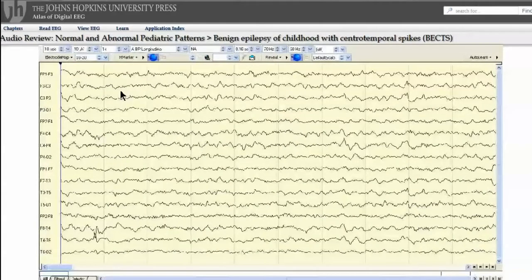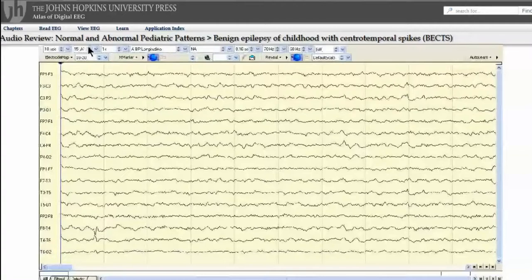This EEG segment in a child shows diffuse theta activity with low voltage faster beta activity superimposed. This is obtained from a sleeping child. We already see at the beginning a phase reversal at T4. To clarify this, we can decrease the gain even below the 10 microvolts per millimeter to 15, and we can see a blunted morphology, phase reversing at T4, with an aftergoing slow wave, exhibiting therefore some epileptiform features.